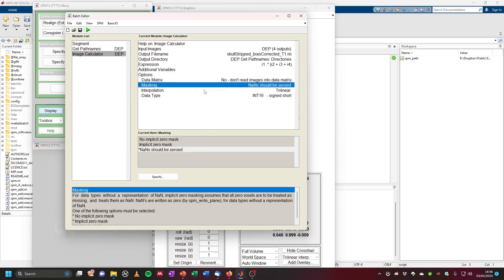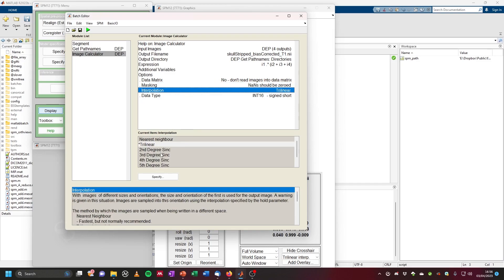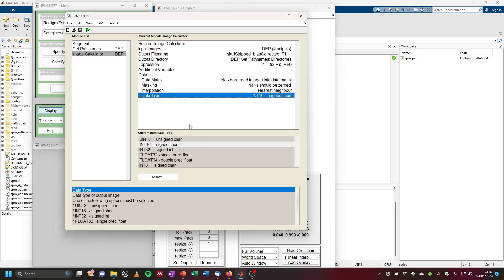Under interpolation, go with nearest neighbor because all images are in the same space, so we don't want any interpolation. As the data type, choose a high precision value — something like float 32 should be good. This will produce our skull stripped image of the brain.